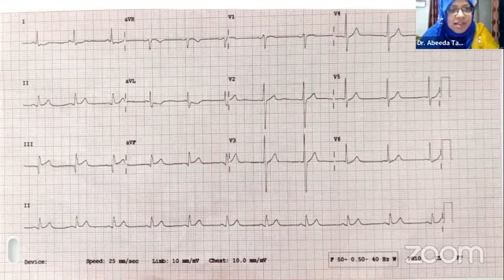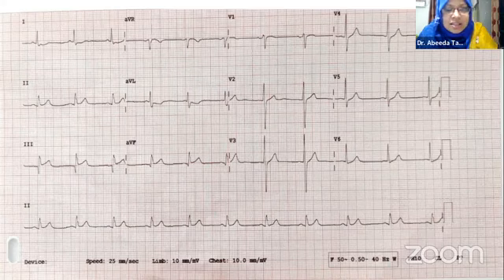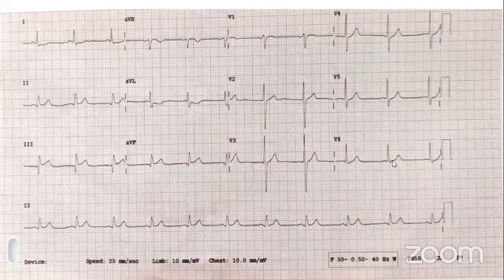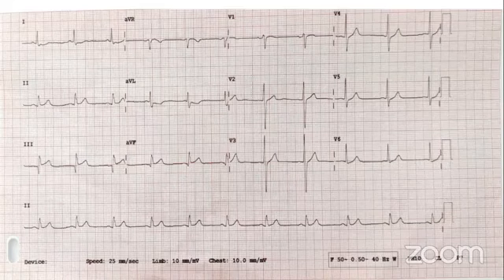Can you please unmute yourself again and say what the ECG change is from the first one? Naim, would you comment about it? Yes, sir.